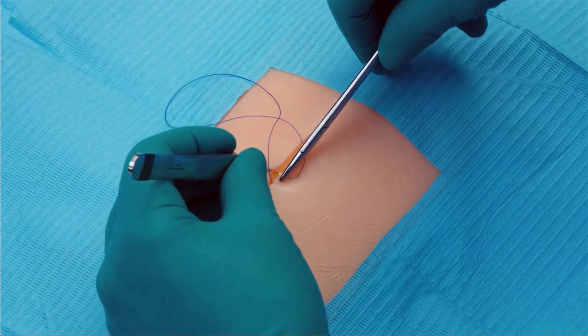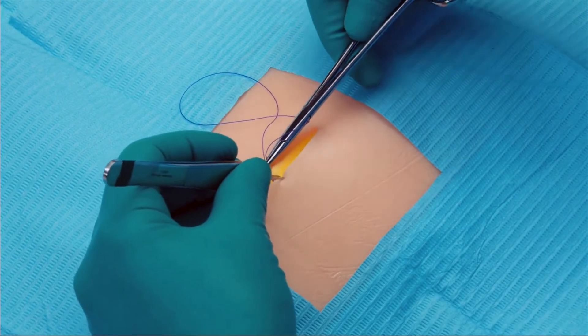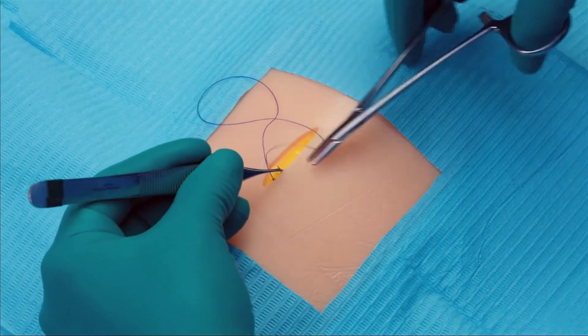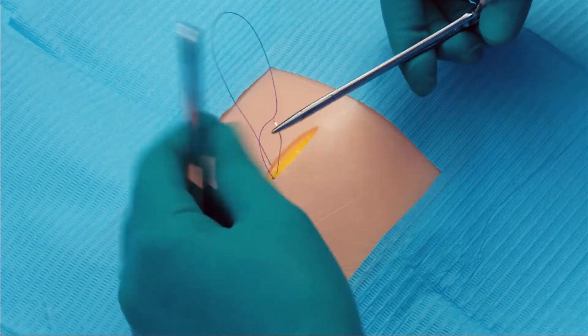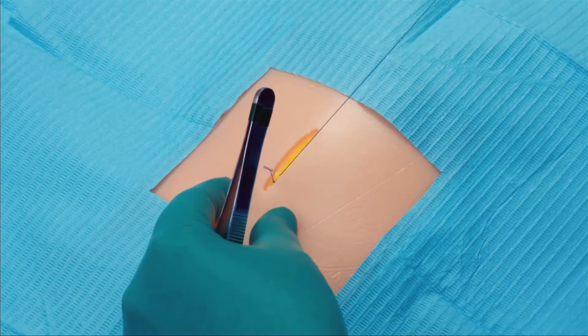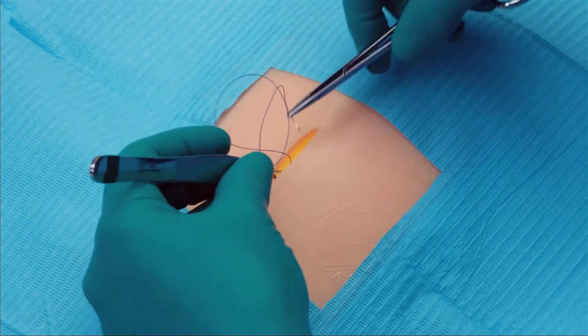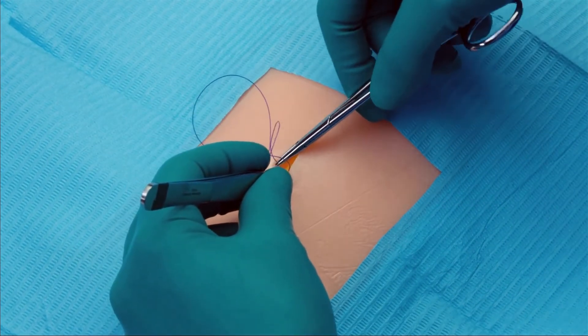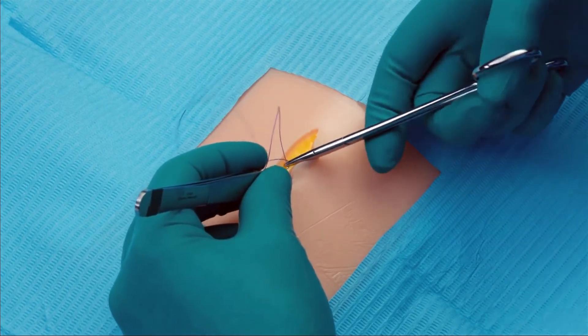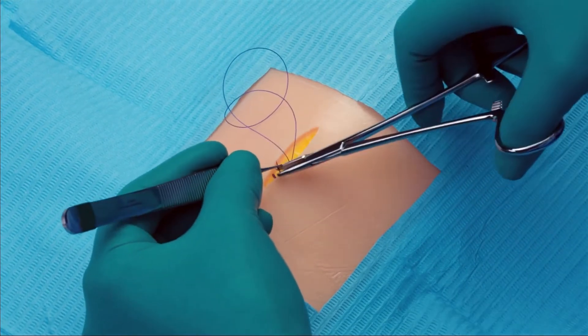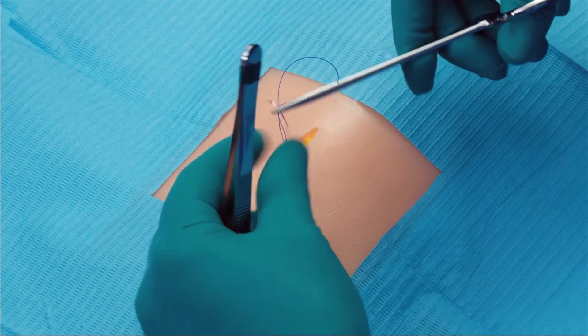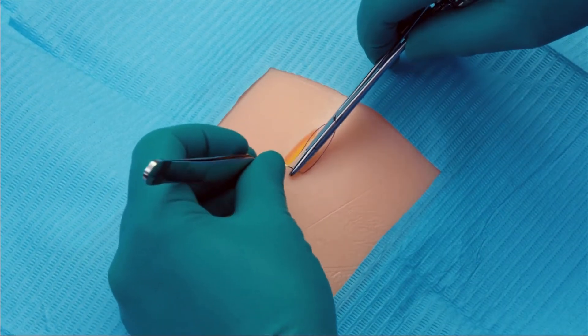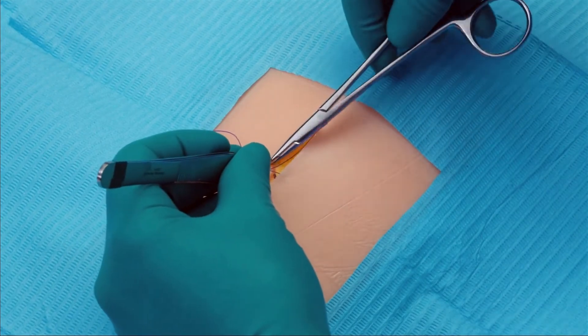Then, we take at least two loose bites of the tissue to be approximated in a simple, continuous fashion. Now, the device can be grasped, and the tissue can be approximated to the desired tension. This helps anchor the quill device and ensures even distribution of tension.